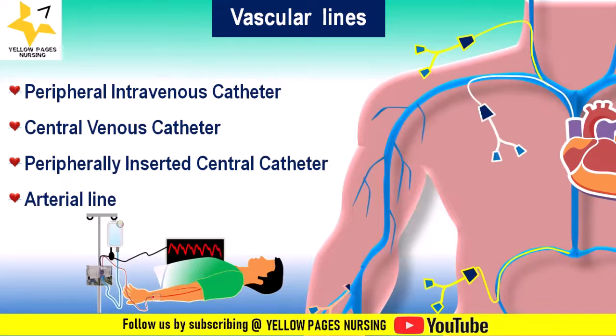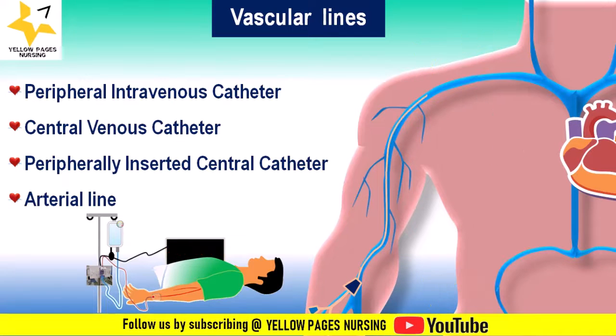These lines are commonly called vascular access devices. There are other vascular lines, for example, pulmonary catheter and dialysis lines. But here, we will be focusing on these four mentioned first. Let's start with peripheral venous catheter.